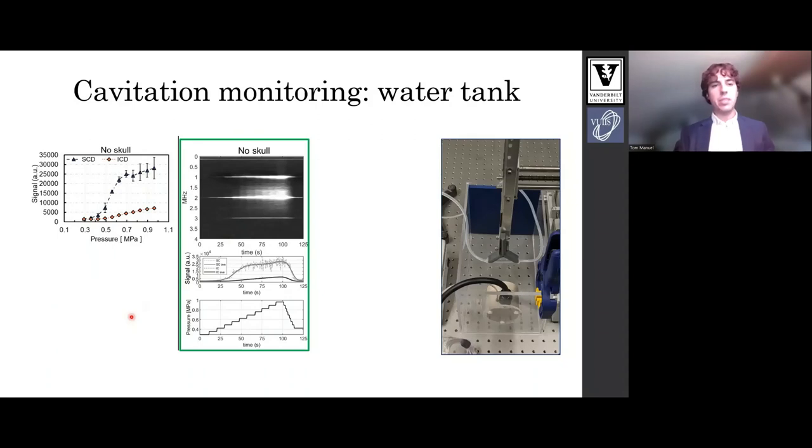Here are results from our cavitation monitoring system tested in the water tank. The top shows a spectrogram of frequency versus time. In the middle is a stable cavitation plot and inertial cavitation plot extracted from the spectrogram, and at the very bottom is pressure versus time. As we slowly increase pressure we can see stable cavitation increase, indicated by the harmonic signals present in the spectrogram. Beyond this there is inertial cavitation, indicated by broadband energy, also detected by our metrics.